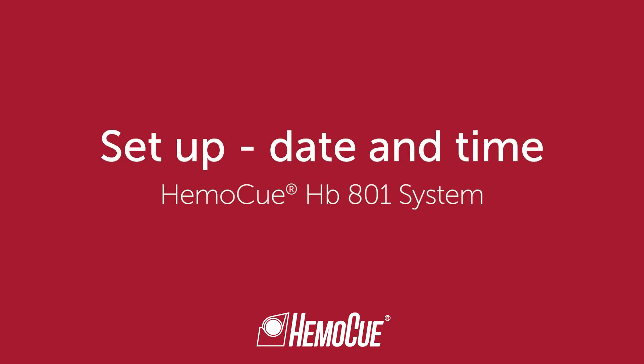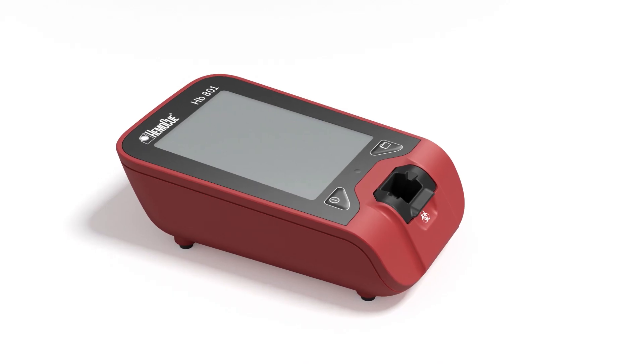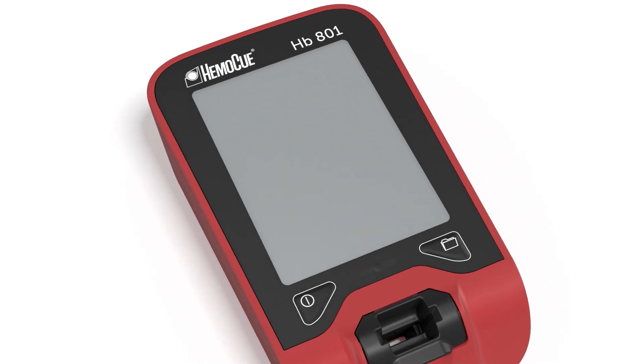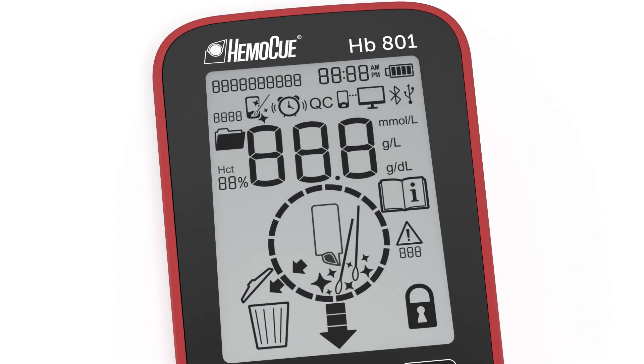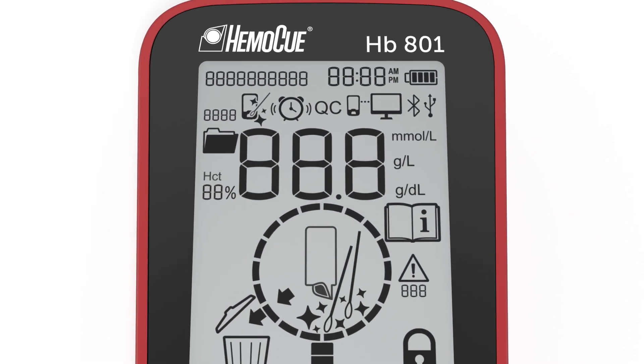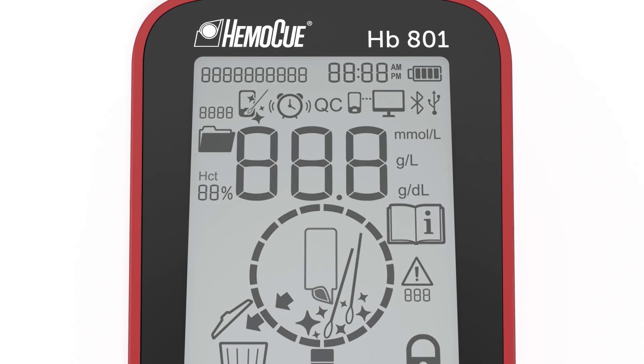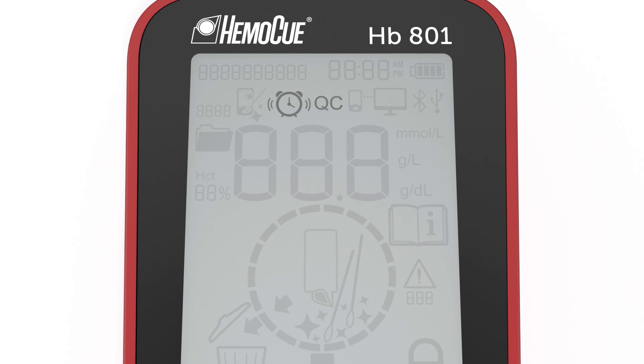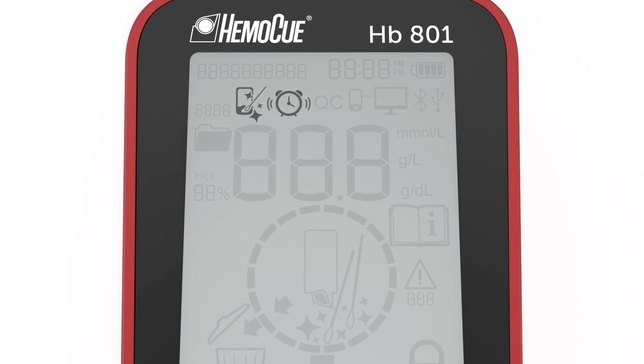Welcome to the HB801 instruction for use video. In this video, you will learn how to set up date and time in the analyzer. The HB801 analyzer from HemoQ includes many features that will make your daily work easier. Workflow and messages are illustrated by symbols and animations, all communicated through intuitive symbols that are easy to understand.